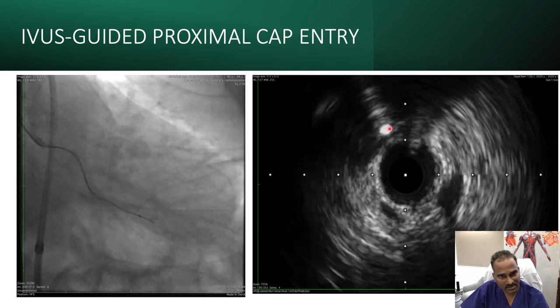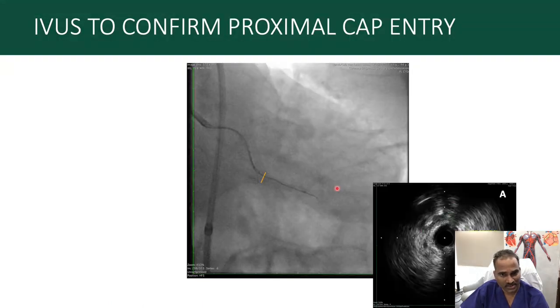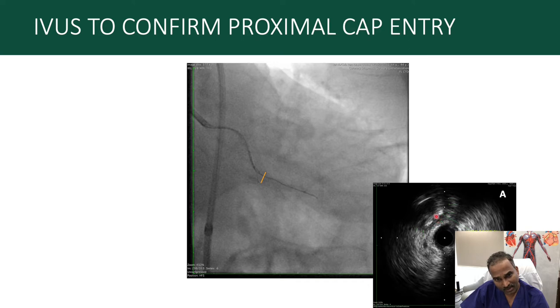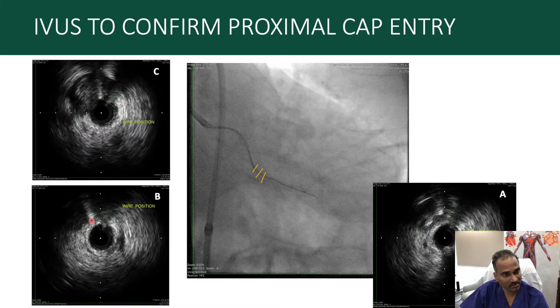We then performed IVUS to assess wire position. You can see the LCX and the OM from which we are performing IVUS. The bright spot is the wire — it is inside the media but not at the center of the intimal plaque. If it were at the center of the intimal block, we could confirm intimal entry. Since it is in the periphery, it is difficult to say whether it is intimal or subintimal — it appeared borderline.